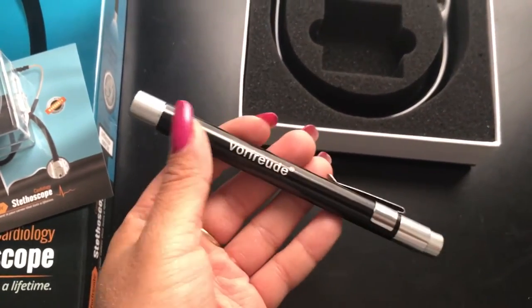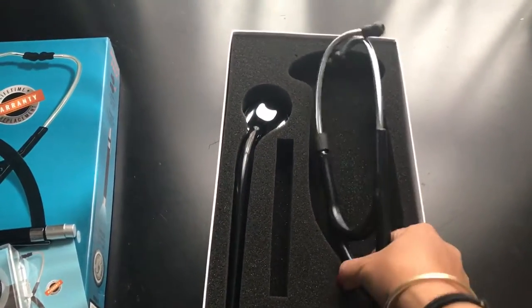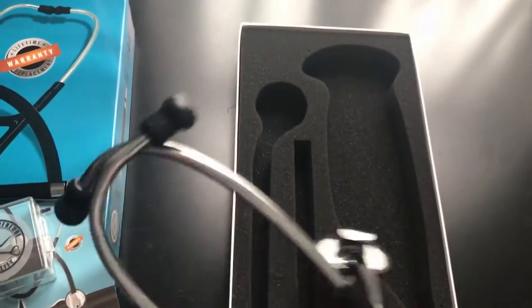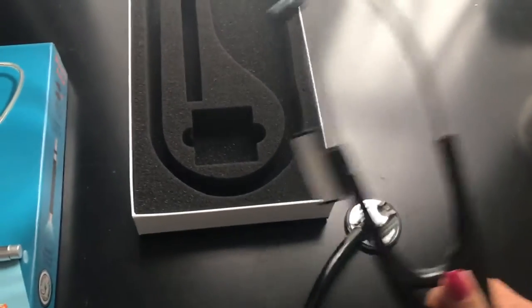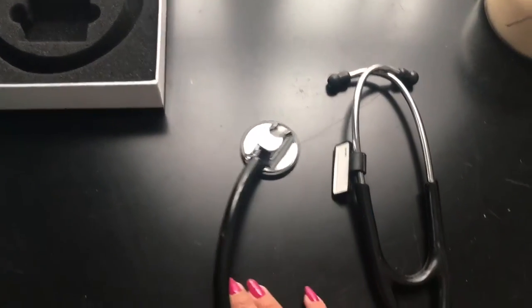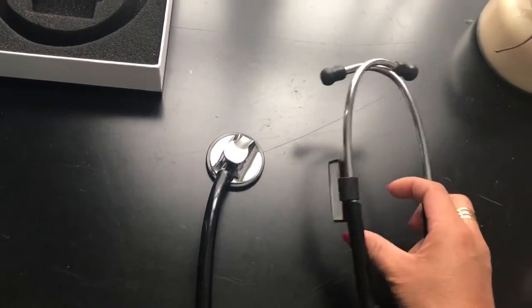There are currently no batteries in it, so it's not working. And here is the main product. In the packaging, it's really well protected. They included a nice little foam insert to make sure it doesn't move around during transit. And here is the stethoscope.